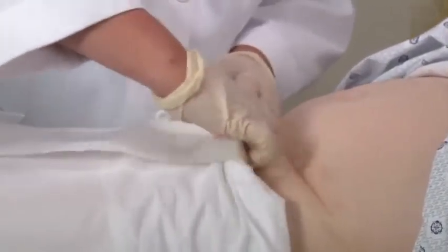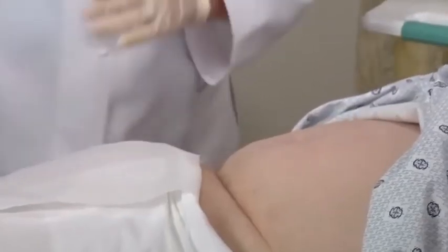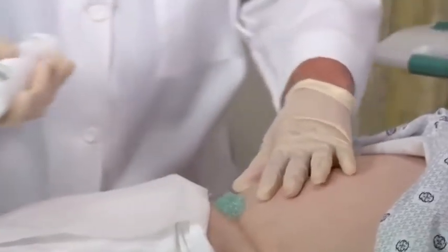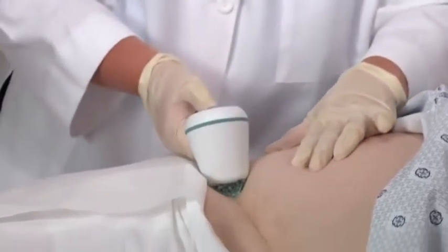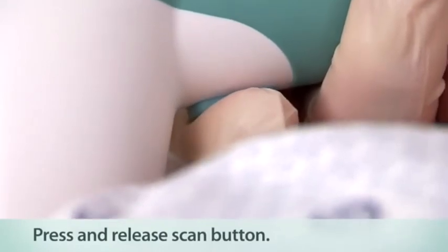Before you do the scan, you want to visualize the area that you're going to scan. You want to locate the pubic bone, because you're going to scan above the pubic bone, so you want to palpate that area. Next, place a generous quantity of gel midline of the patient's lower abdomen, about one inch or three centimeters above the pubic bone. Standing alongside the patient's right side, place the probe on the gel and aim it downward behind the pubic bone towards the expected location of the bladder. Press and release the scan button located on the underside of the probe.